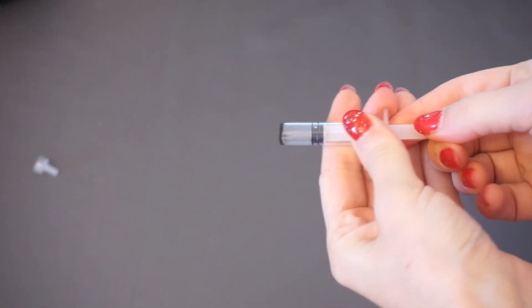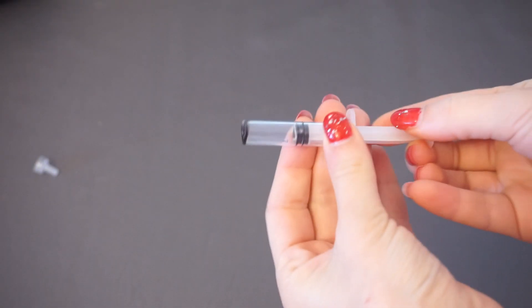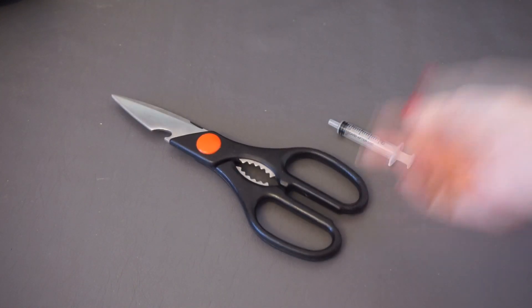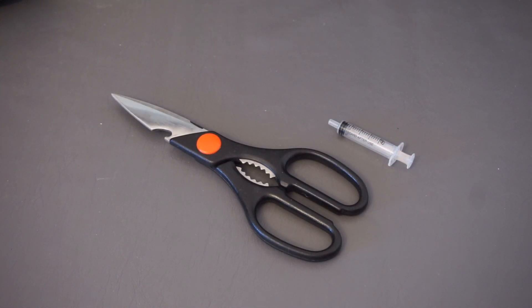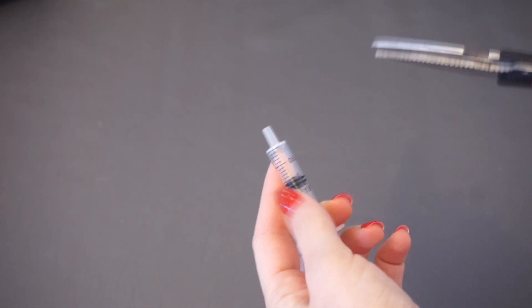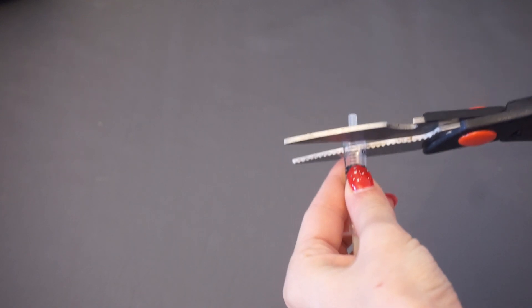So I read a few veterinary articles on the matter, got a consultation, and decided to make a DIY breast pump for cats. For this you are going to need scissors or an office knife, a lighter or matches, and a syringe. Cut the syringe tip.